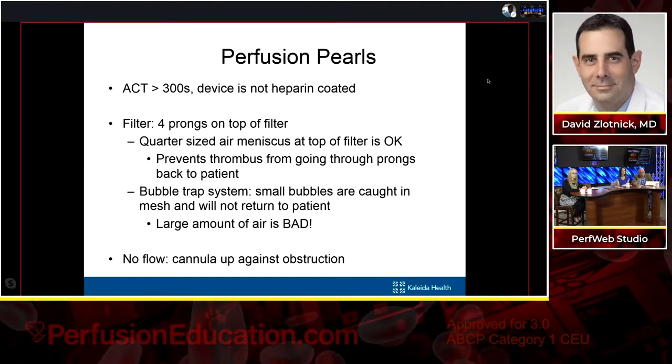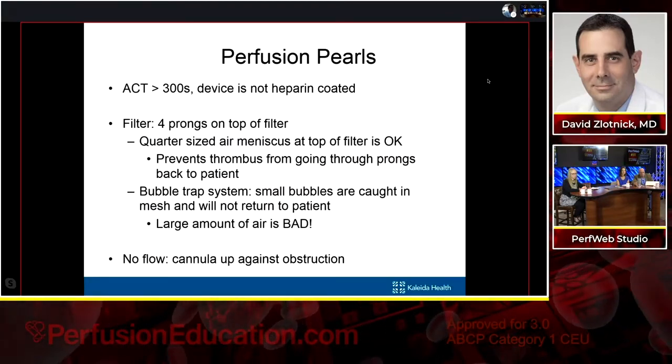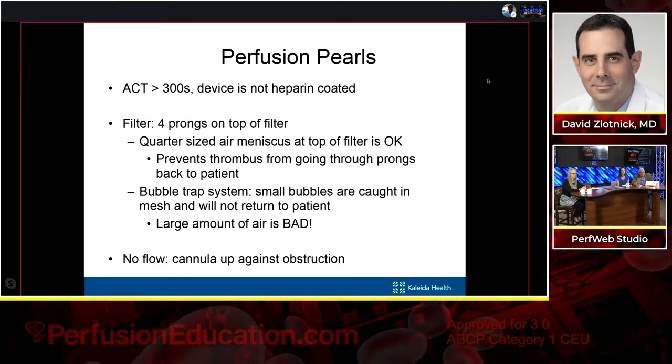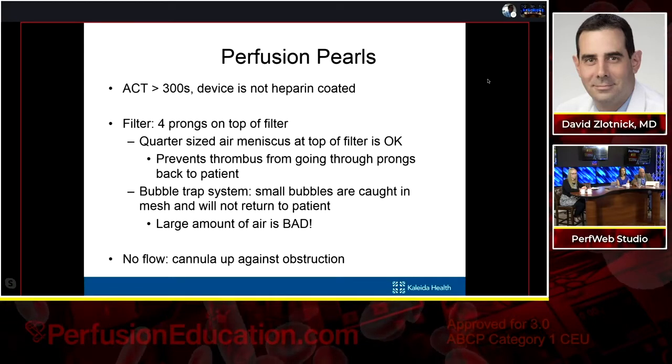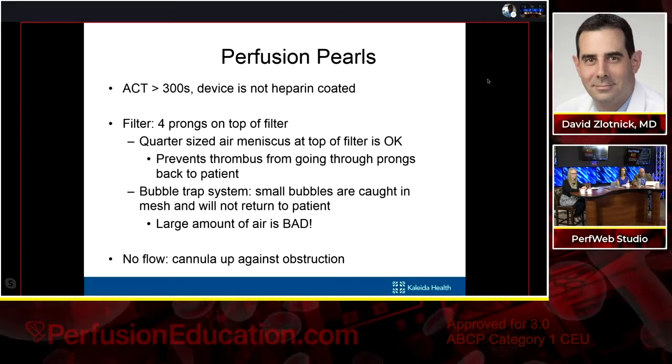And though I'm an interventional cardiologist, I do a lot of work with our perfusionists. They're involved in our TAVR program, our STEMI program, and obviously with the AngioVac program. And so I asked them when I was giving this talk, and I've given talks to other perfusion schools, what are some of the things that you want me to remind your colleagues about?